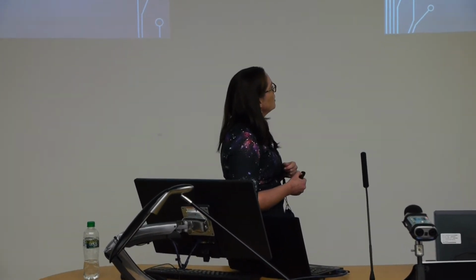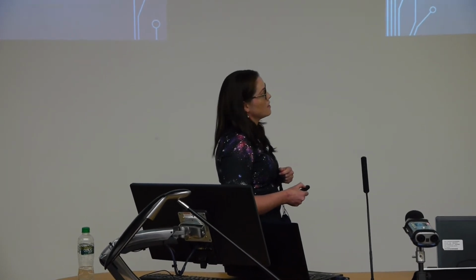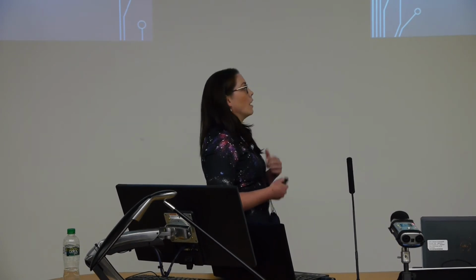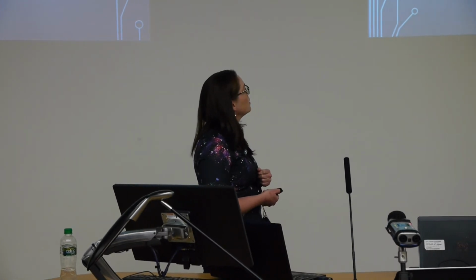Another example. So the tumour's there, we can definitely see the tumour, but our lung density has changed. So we've got this high density here, and that's going to affect, in this case you'd have to actually look at your treatment plan and see where. If you have no beams coming in this way, then it's fine, it shouldn't make an enormous dosimetric difference.